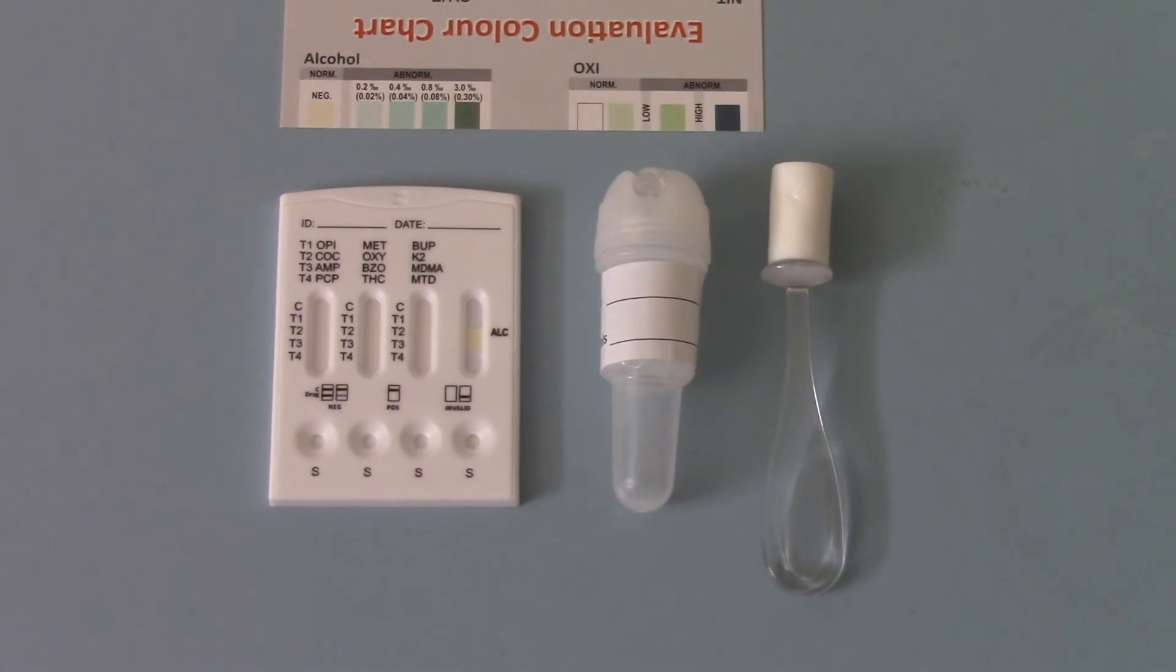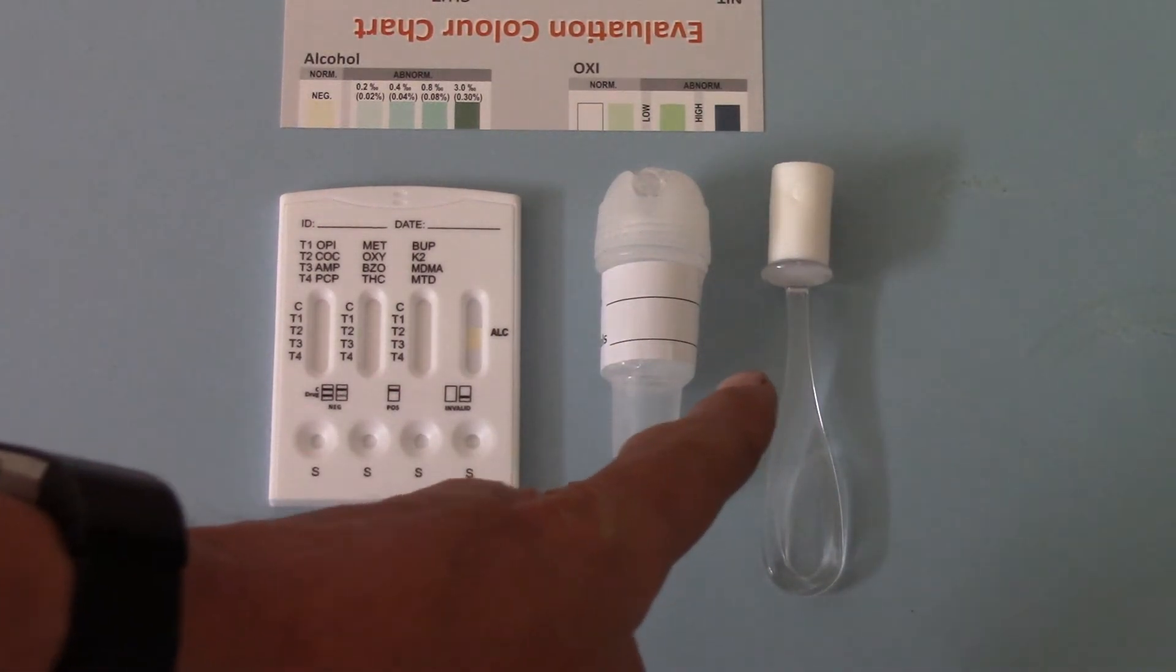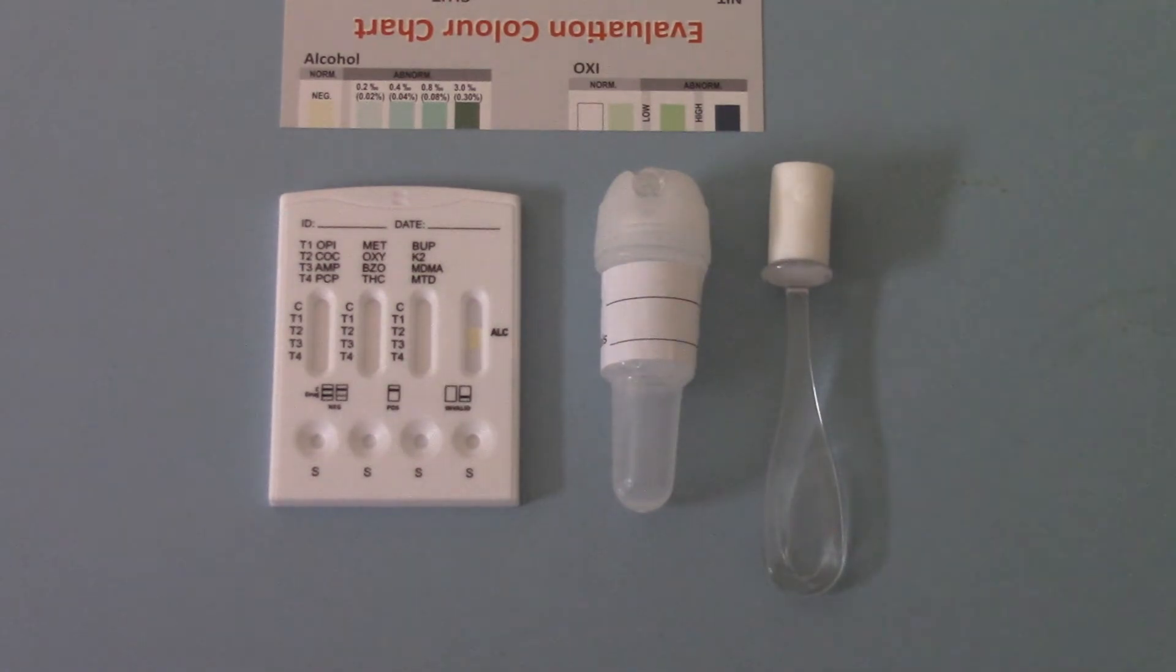So what we're going to do now is saturate the swab collector in a saliva sample, process that through the collector for you, and add it into the sample wells to show you the test running.